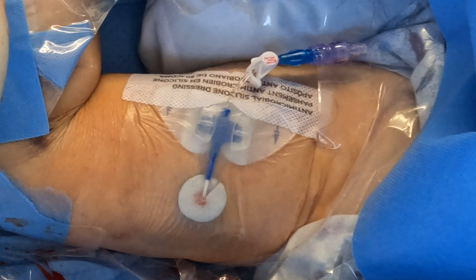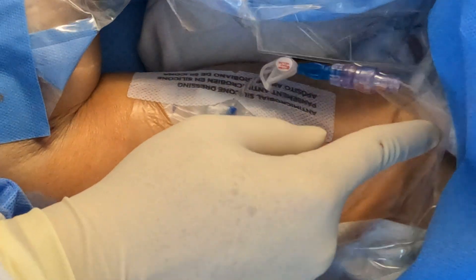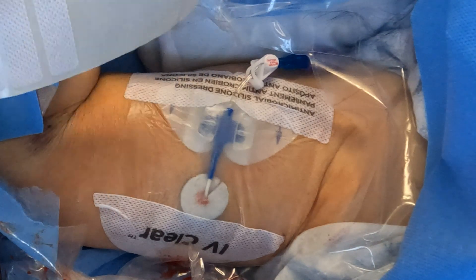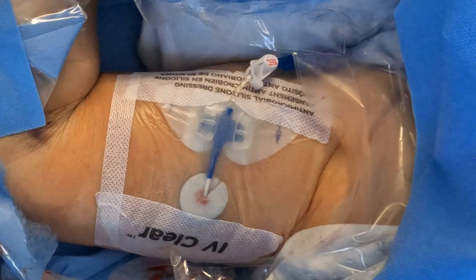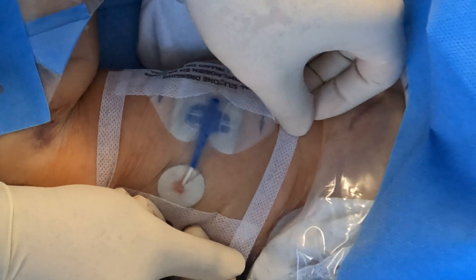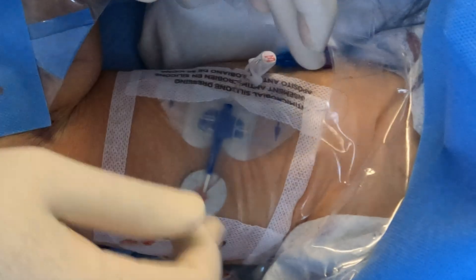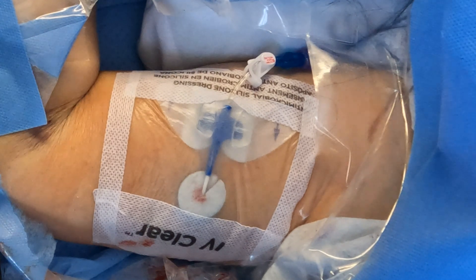I think that's all we need — we don't need anything extra. Don't forget to date and time it. Remember, the silicone is a lighter adhesive, so if your patient is extra sweaty, consider using Mastisol to reinforce the edges to make sure it sticks on very well.